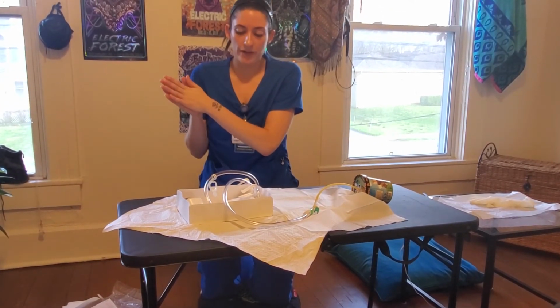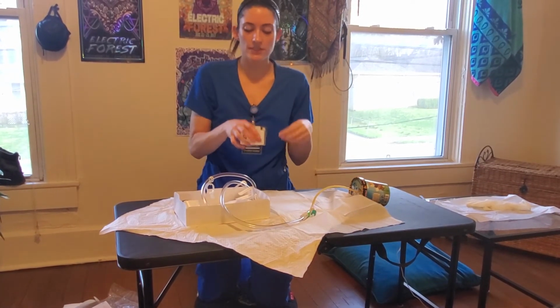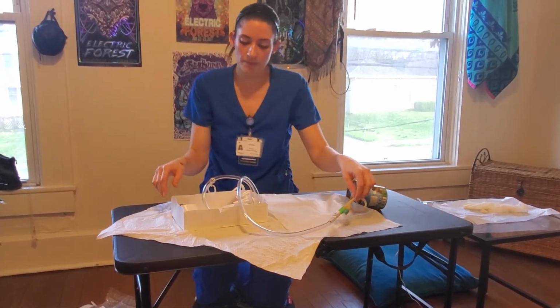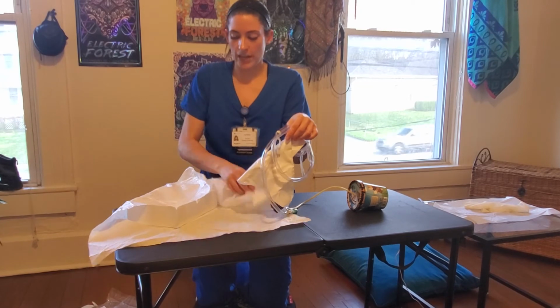And then we will be taping the catheter to the patient's leg. We want to make sure it's nice and secure so it doesn't get tugged. So I'm going to loop it up here, tape it to the patient's leg. I'm going to go ahead and dispose of all the rest of this because it's time to attach the catheter.